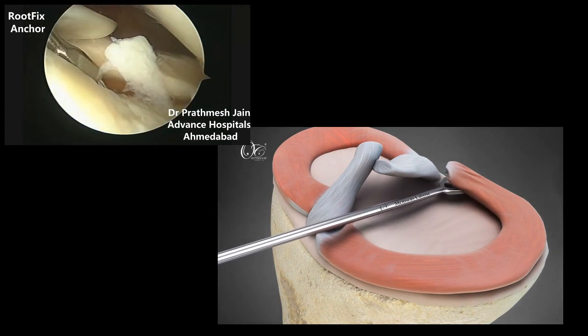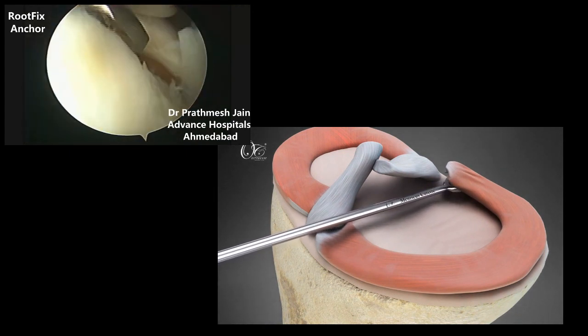The subchondral bone serves as the biological bed for healing, prepared with the help of a meniscus curate.